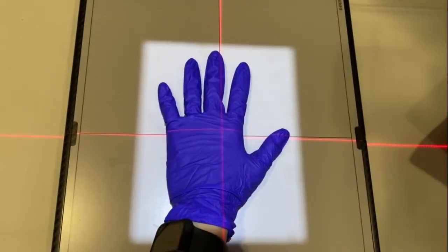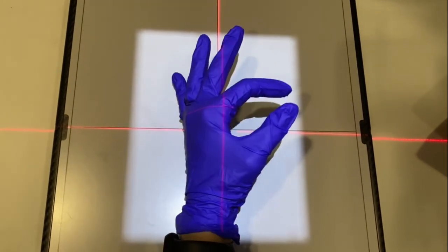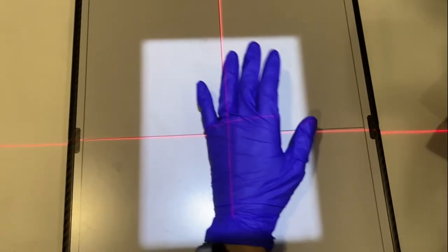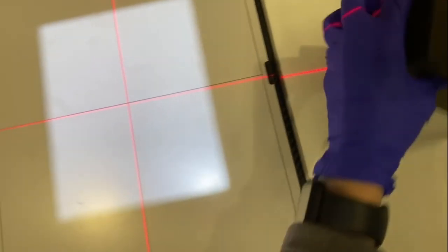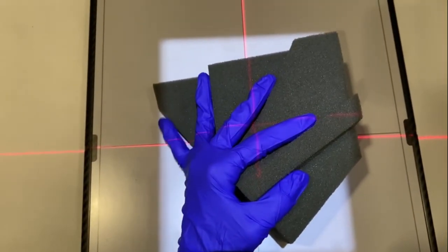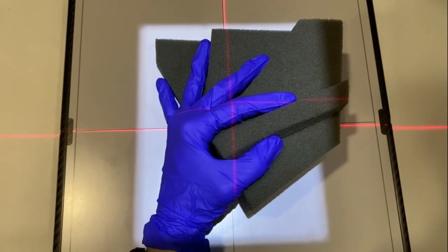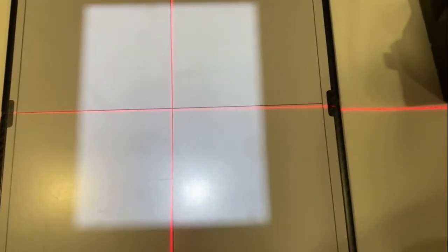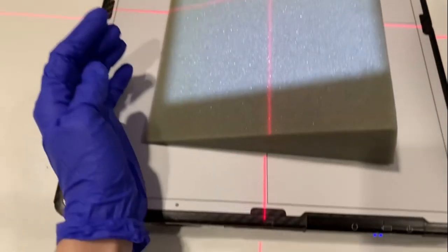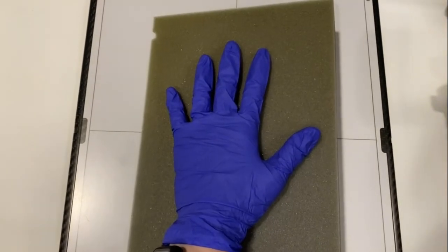This is a PA hand, an oblique hand, and a fan lateral. Now some people can't do this, and babies have a really hard time doing this. So we have positioning aid sponges. This one will help with the fan lateral to get all of the fingers from being superimposed. This is an angled sponge to help with the oblique projection, and typically the PA isn't an issue.